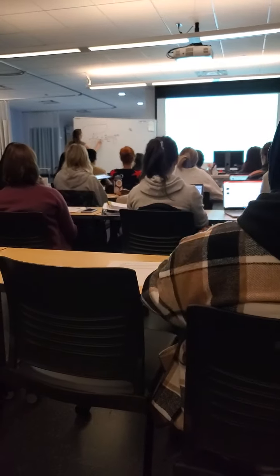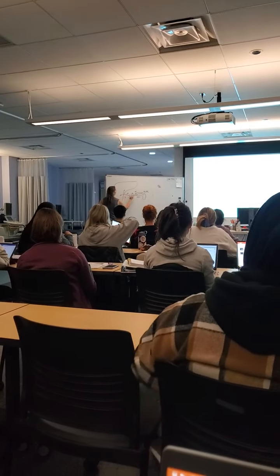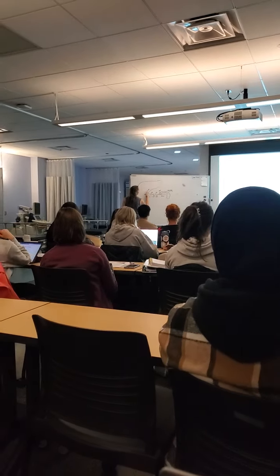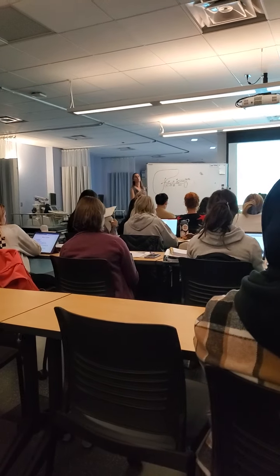So, biliary system. We think about the biliary system as being just the gallbladder, but there's a lot more to it than that. We have the gallbladder itself, intrahepatic ducts, which we typically don't see unless things are awry. We have the right and left, so our bile is flowing from those biliary canaliculi into the right and left hepatic ducts, then into the common hepatic duct, and then we have the cystic duct hanging off, which we don't typically see, and we have common bile ducts. So everything from common hepatic duct down to the pancreas is what we consider our extrahepatic ducts. So those are the ones we do visually see.